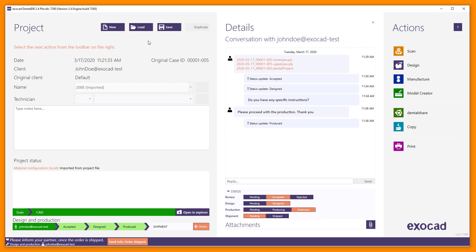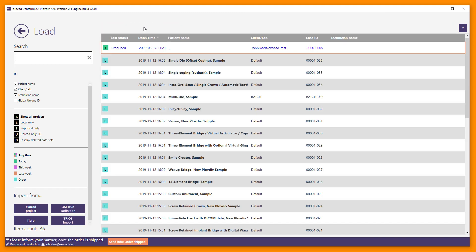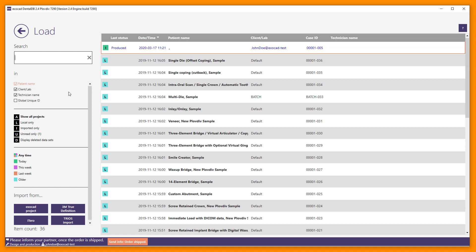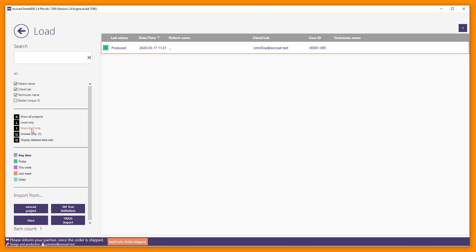The received DentalShare cases are added to the load list. In the Last Status column, you can see the status of the order. Projects you have received via DentalShare are categorized as imported projects. Note, you can filter the list by imported-only projects to help find the received DentalShare case faster, or by unread. New unread projects will be highlighted in blue.